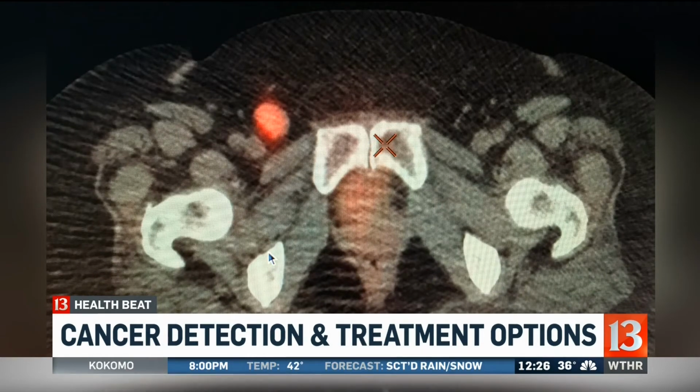What are the benefits to patients in going through this kind of scan? Well, the PET scan does a couple of different things. If you see a lump on a CAT scan and you're not sure what it is, the PET scan can help you find out if it's cancer, so you can make the diagnosis. It also helps the oncologist with the treatment. You see the primary tumor, and you can see if there's other disease at the time of initial diagnosis. That's really important to see if the cancer has spread, so it helps the oncologist know how extensive the cancer is.